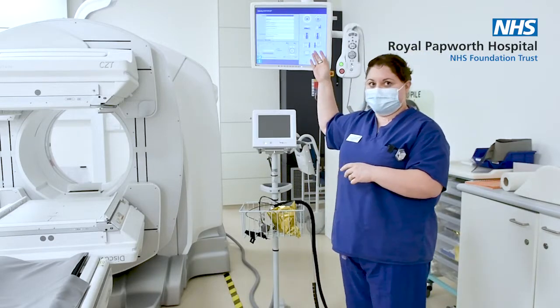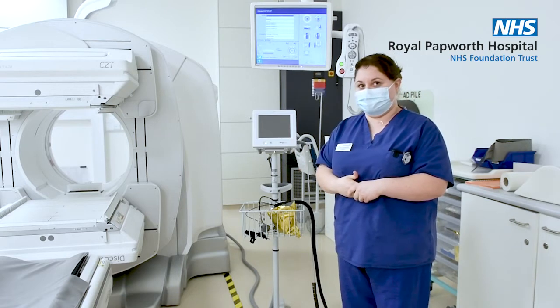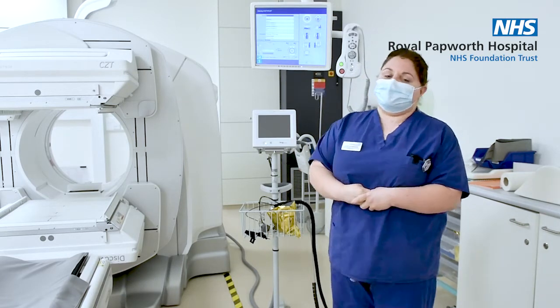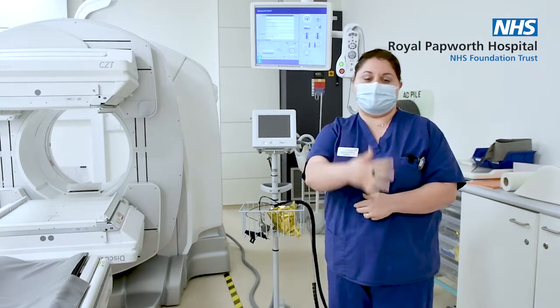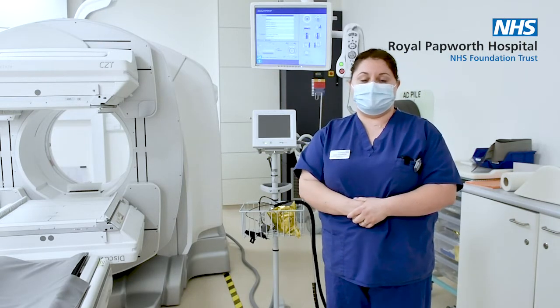The images are displayed on the screen here so we can see it in real time, and the patient can also watch it as we're doing their scan. Normally the patient is injected with a radioactive isotope an hour prior to the imaging because it needs an hour to circulate round the body and absorb into the heart muscle and allow us to see the images.